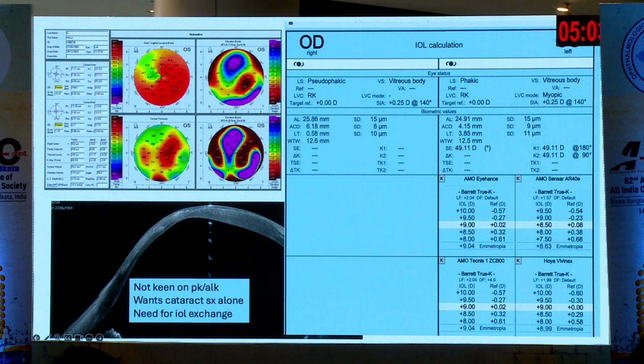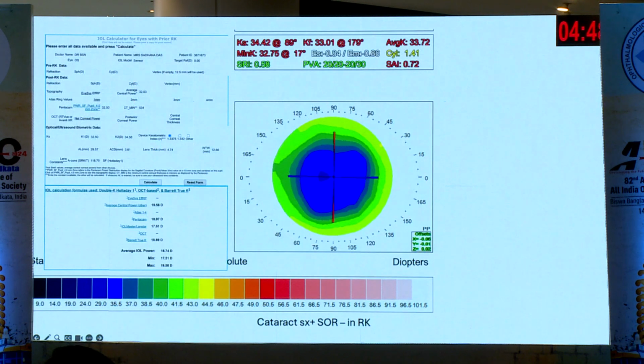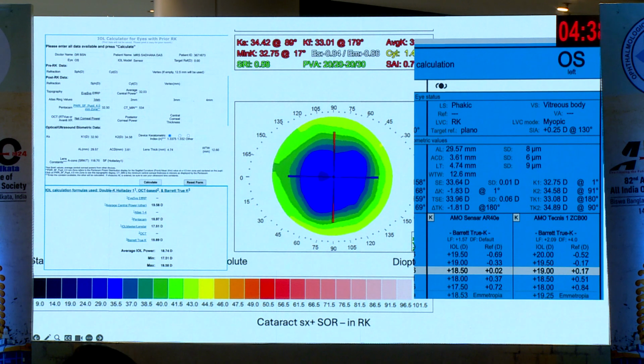So I kind of said, okay, I'll take the value which is closest to the other eye, because both eyes to begin with had a similar refraction. But having said that, this ectasia is progressing, so I would still have been hitting in the dark, not knowing what I'm targeting. So this is another interesting case where patient had an RD surgery, post-RK patient, had oil and needed cataract surgery. And topography was reasonably regular, so fine, surgery went on fine, absolutely fine.